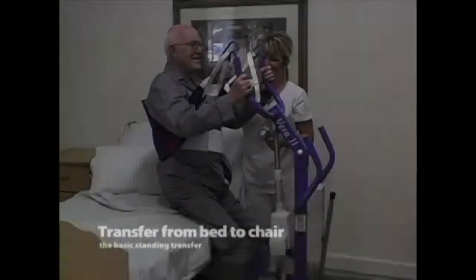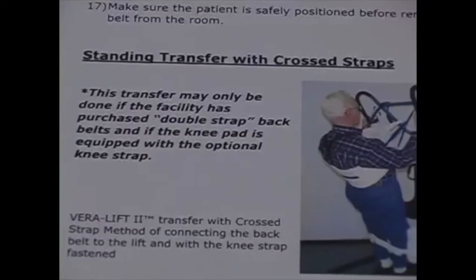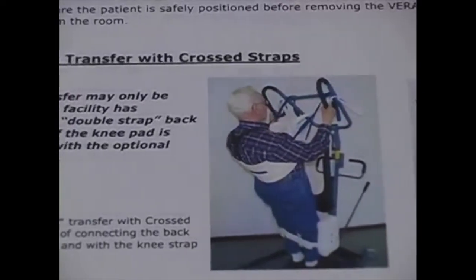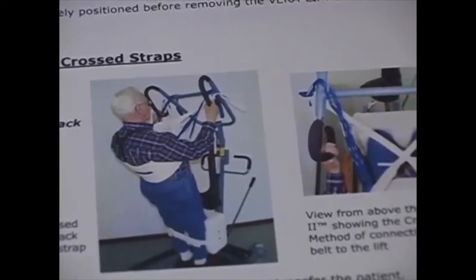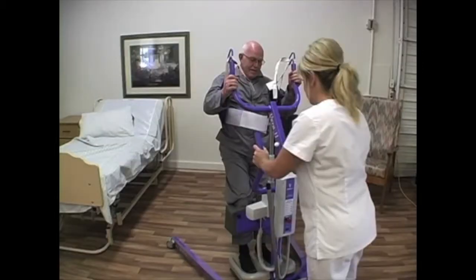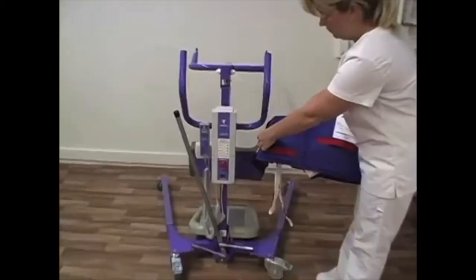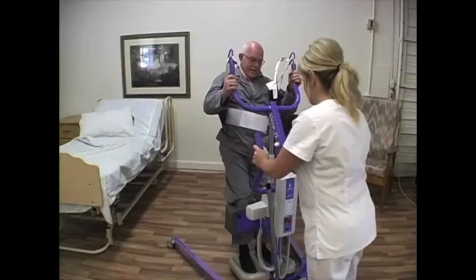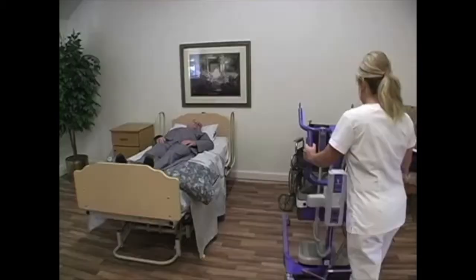Transfers. Transfer from bed to chair — the basic standing transfer. Two methods of connecting the back belt to the lift arm hooks can be used for transfers. Refer to the VeraLift 2 operations manual or contact your distributor for client selection criteria for each of these methods. Before transferring the client, be sure to perform all pre-transfer procedures, which include checking the care plan, the required number of staff, which size back belt, and which method of connecting the back belt to the lift arm hooks is to be used, perform lift and sling inspection, and do a pre-transfer trial run.